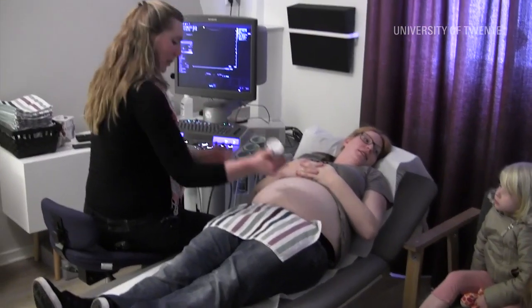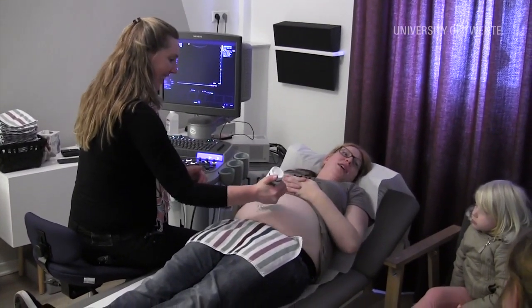In this case, we will present a pregnant lady in the 20th week of her pregnancy. Previous scans showed the pregnancy to be progressing as expected. As part of the 20-week scan, we will evaluate the fetal heart. In the 20th week of the pregnancy, we can now assess and evaluate the fetal heart for congenital abnormalities.